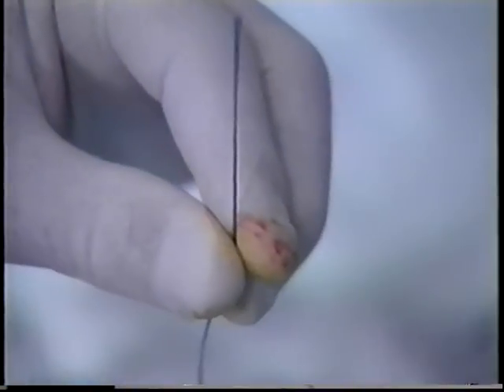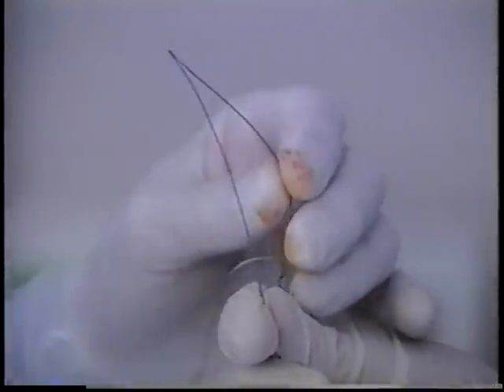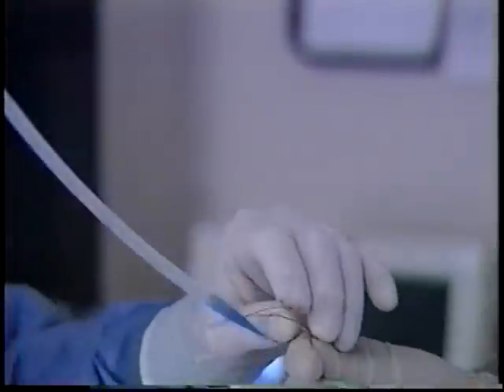scope. The insertion wire exiting the patient's mouth is attached to the tapered dilating segment of the PEG tube. This is accomplished by inserting the big loop of the insertion wire through the little loop on the PEG tube. The PEG tube is then threaded through the big loop, internal bolster end first, and pulled to tighten in place.